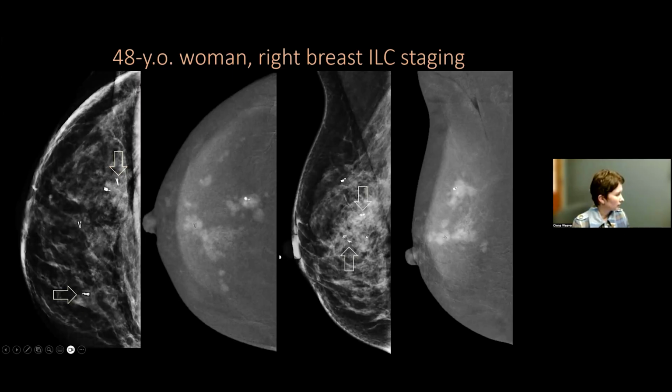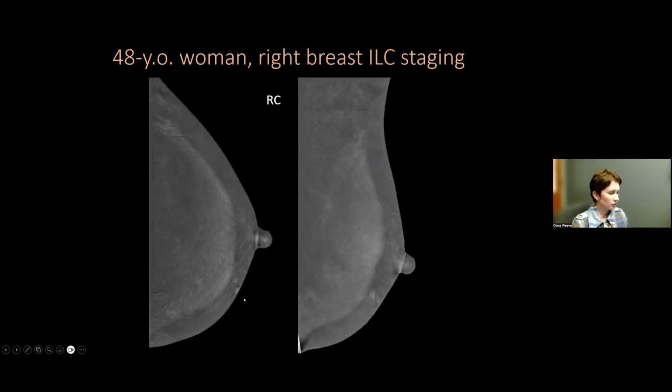And these are our new clips on the lateral view, and we did know that the disease is mostly spread in the transverse view, so they are not very far from each other here. And again, pay attention to some little cutaneous cherry hemangioma, like in this case.